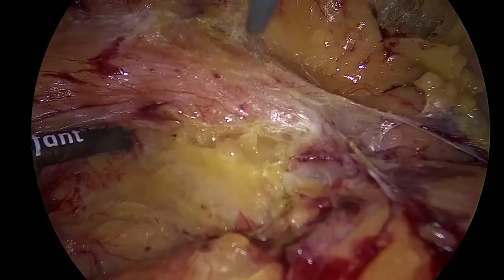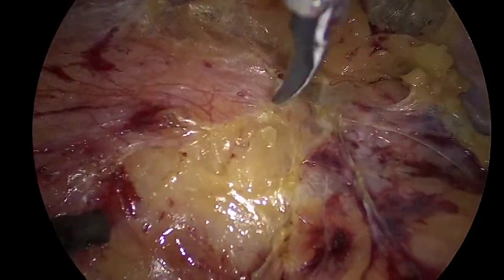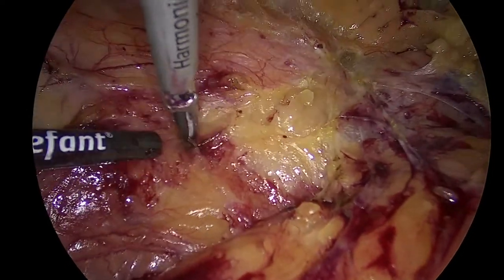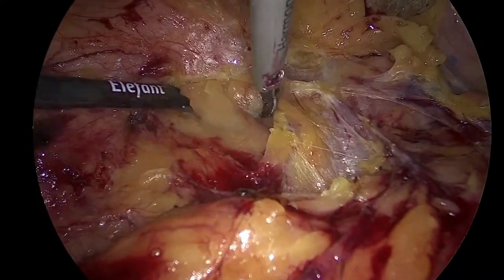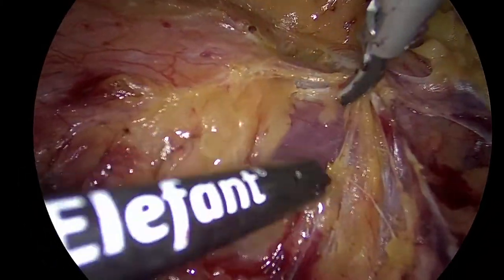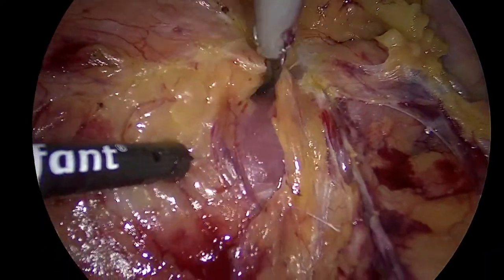Evangelos, will you perform the zero ischemia? We will see. Normally, I always prepare the vessels. If it's exophytic, I start with no ischemia, but then if I have bleeding, I'm ready to deal with everything the right way. Come in. This psoas muscle here, nicely seen.